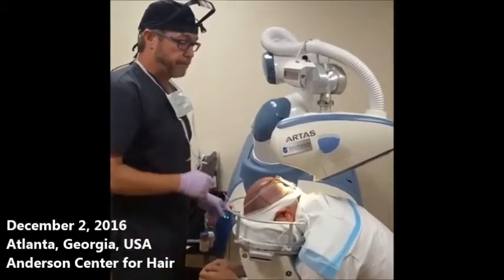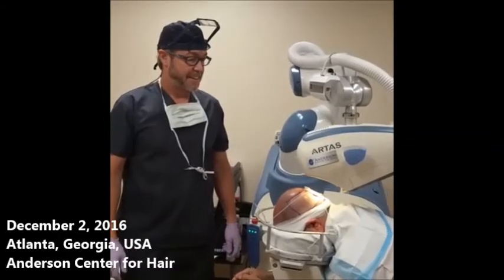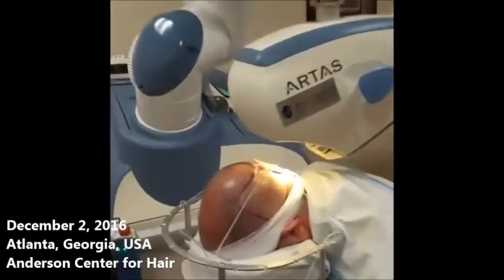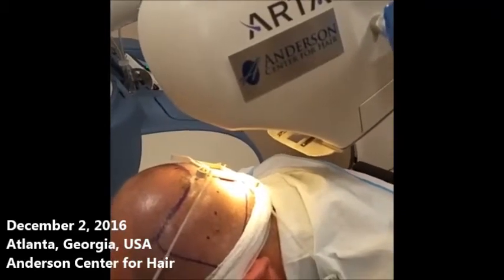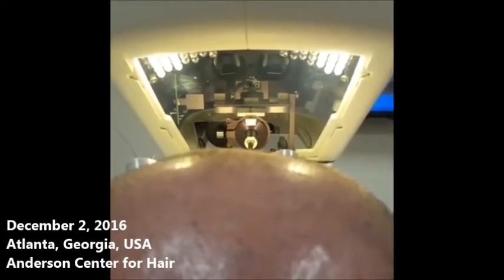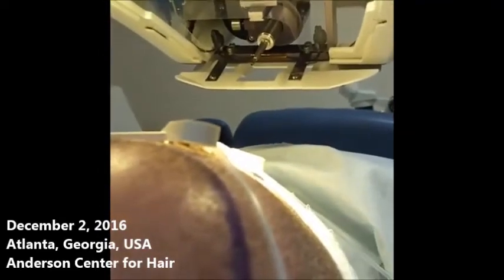The arm is going to orient itself to the tensioner. Here it is in position — we've got the white light system with the very latest upgrades. You can see up under there, like two eyes looking at you — those are the stereoscopic cameras. In concert, they are able to see the angle of the hairs and extract them with robotic precision.